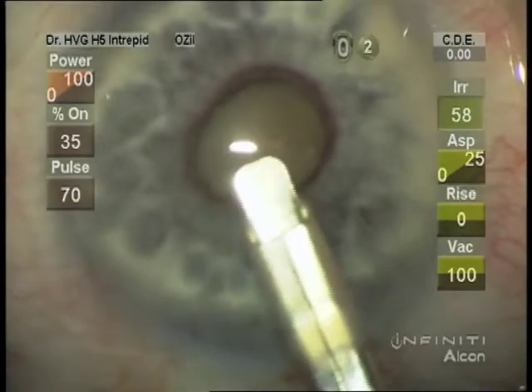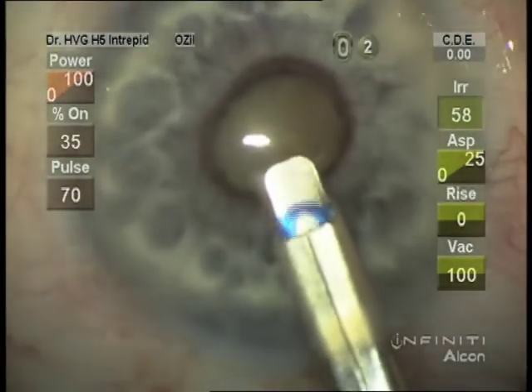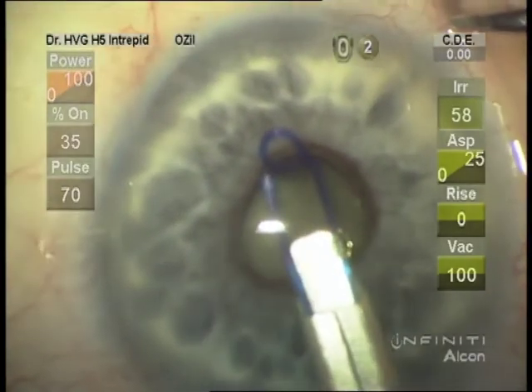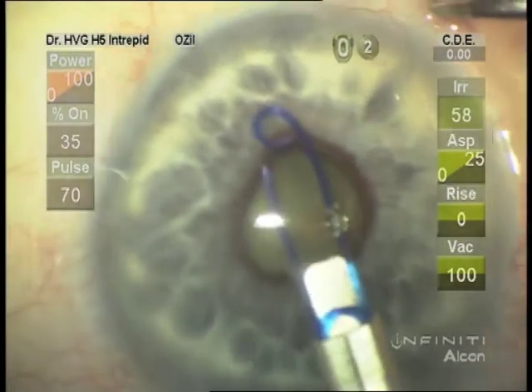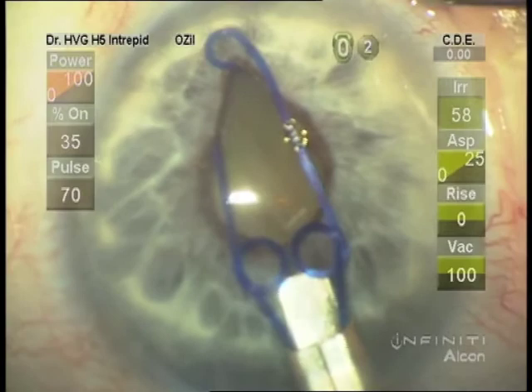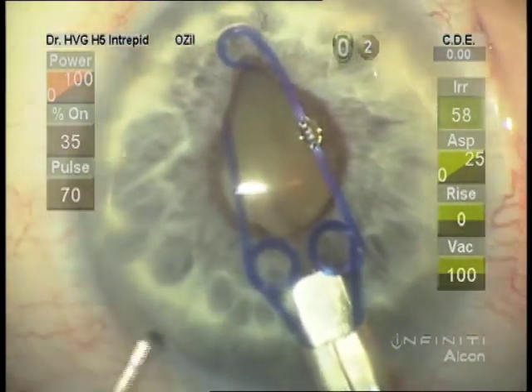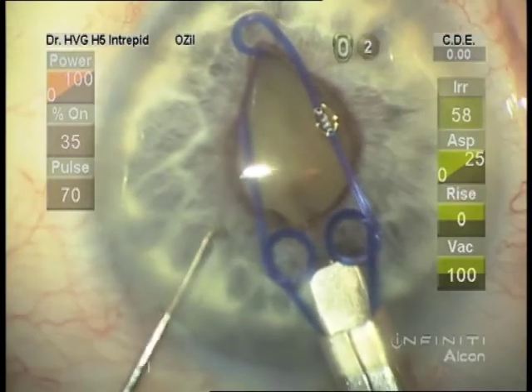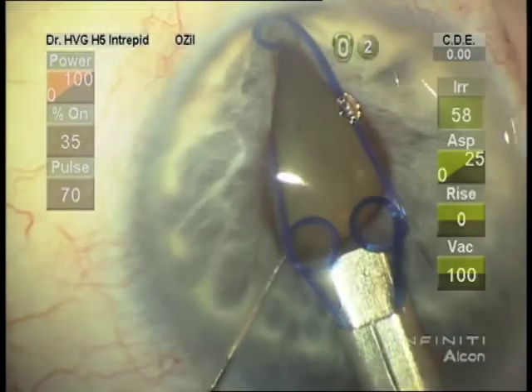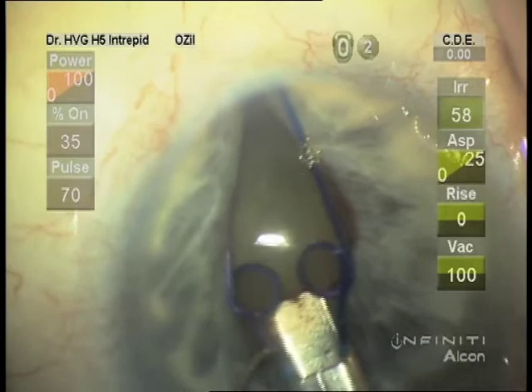I don't always put it in upside down — I'm not sure why it was done that way in this case; I should say I don't usually do it that way. This pupil is so small that we're not going to be able to engage those side loops without pulling the iris with the synechiae hook.